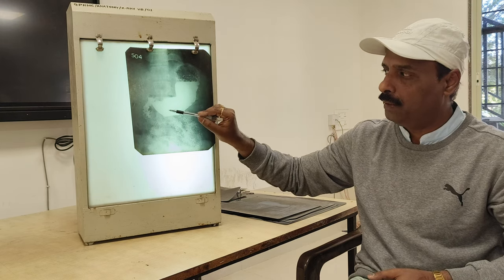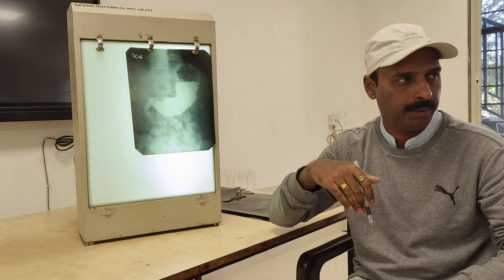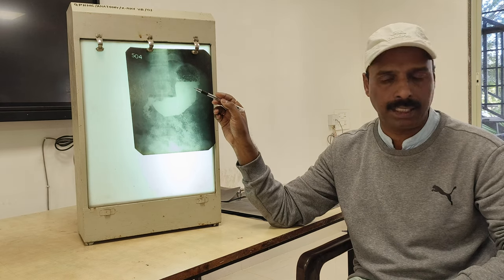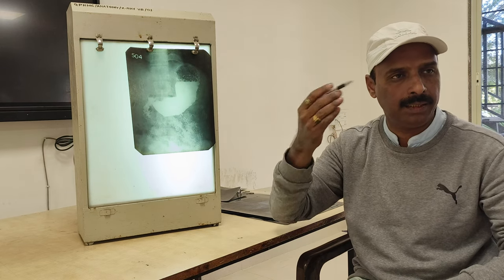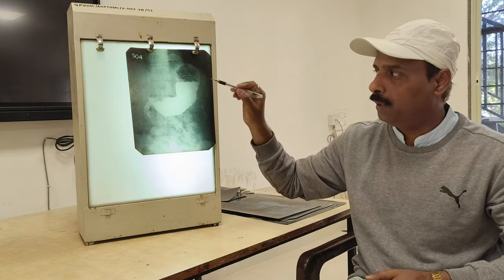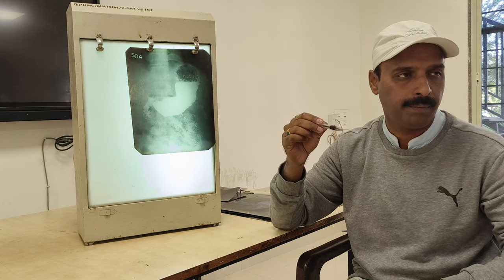After the person is made to drink the barium, this is barium sulfate that we use. Barium sulfate has a milk-like, whitish appearance, and the patient is made to drink it. While drinking we take the barium meal x-ray. If you want to highlight while drinking, the esophagus can be traced. We can take the x-ray of the esophagus. Then after drinking, you can take the x-ray when the barium sulfate reaches the stomach.